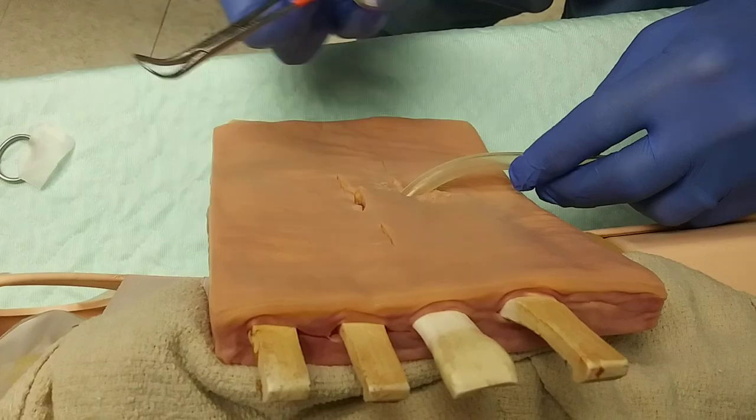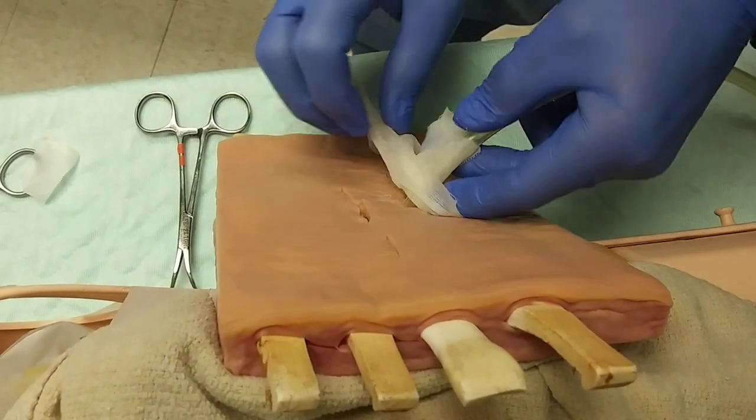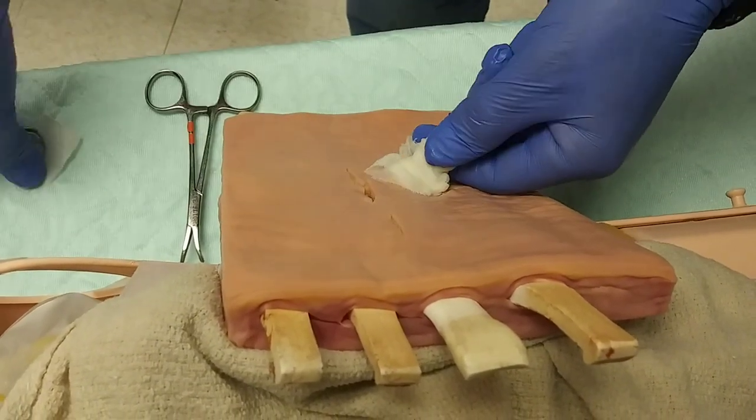Once the chest tube is properly in place, we're going to make sure we apply our Vaseline gauze like we would with any chest tube to keep that from moving around.